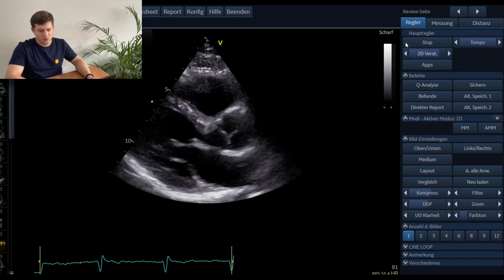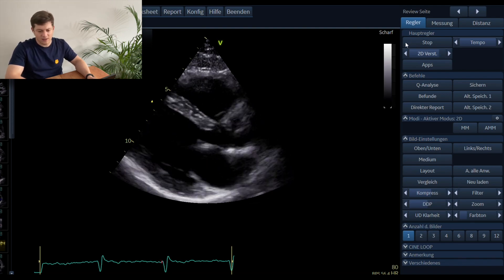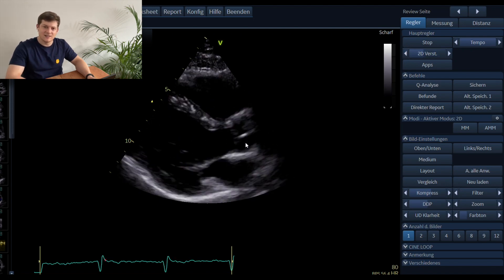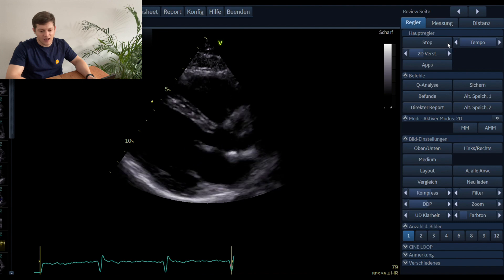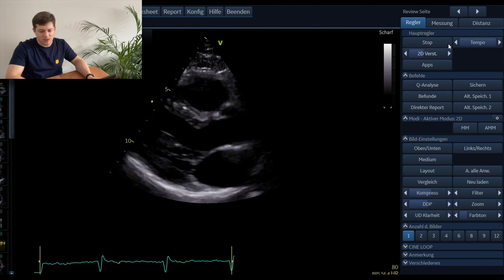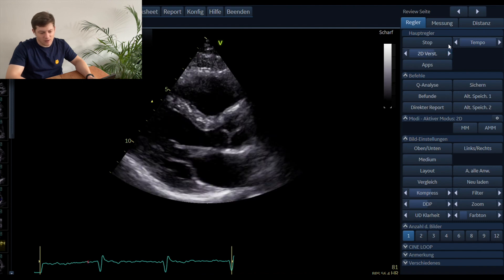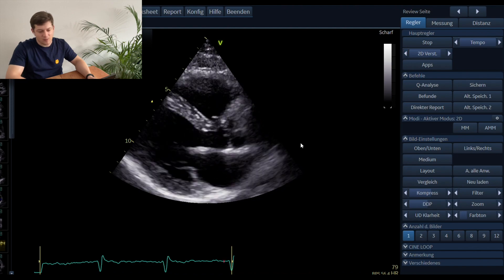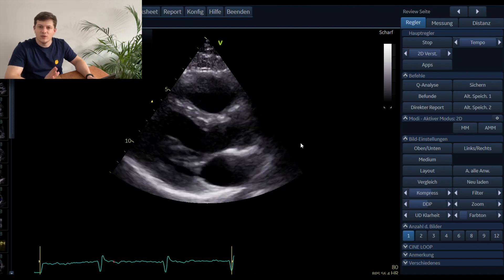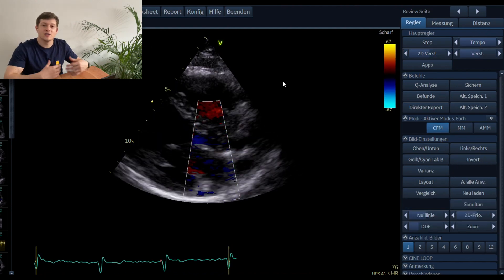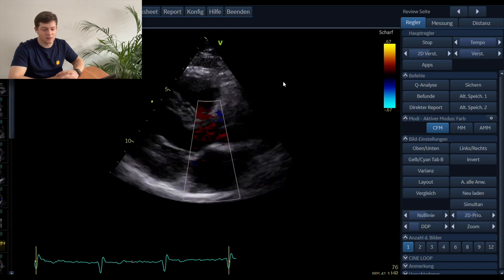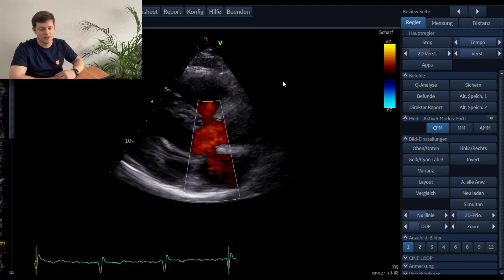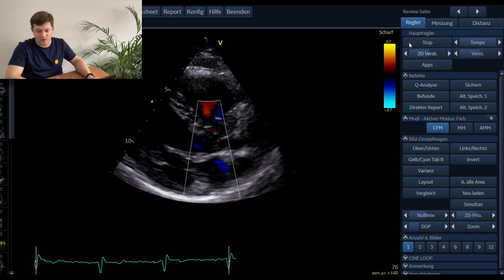If the image is too bright you can reduce the gain, but if the gain is too low you don't see anything. So we put a little bit more gain on. When examining the heart in B-mode, what you initially want to do is place the color Doppler on the image.